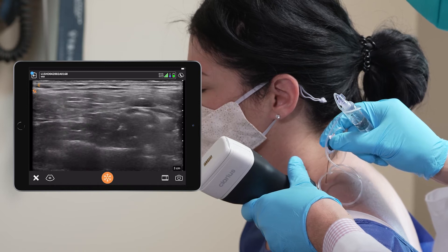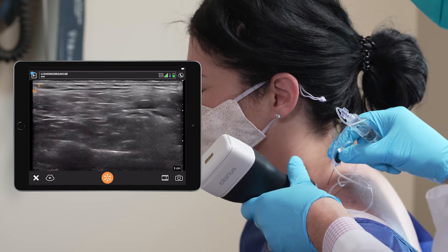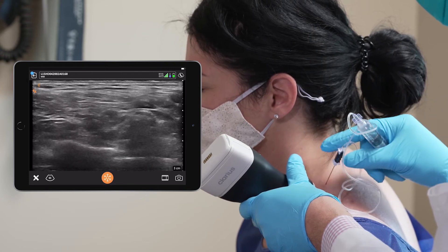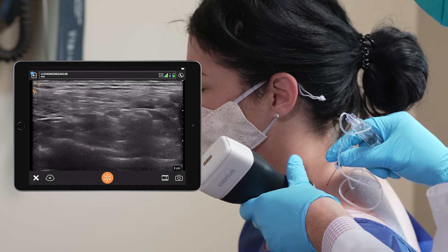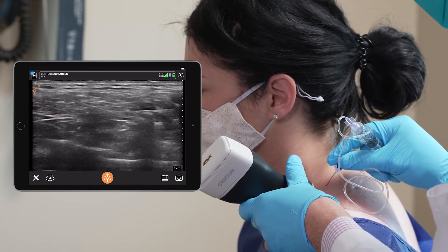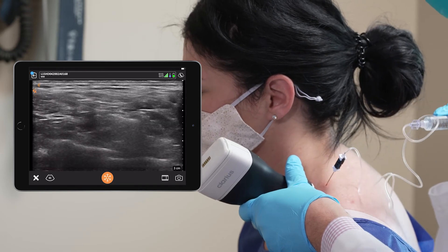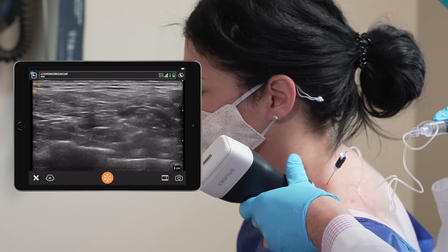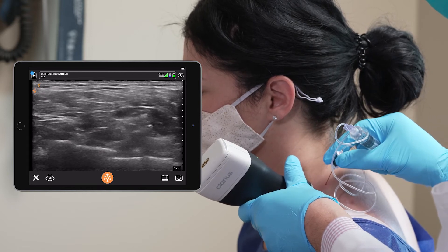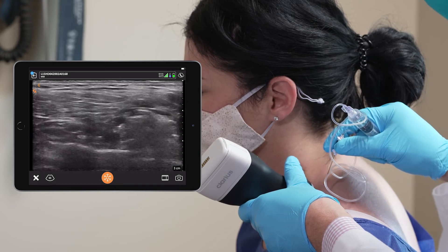I'm just going to a different aspect of the nerves. We're giving a few milliliters of bupivacaine mixed with dexamethasone around the brachial plexus in the supraclavicular fossa.